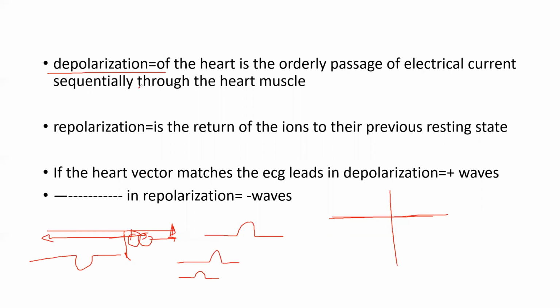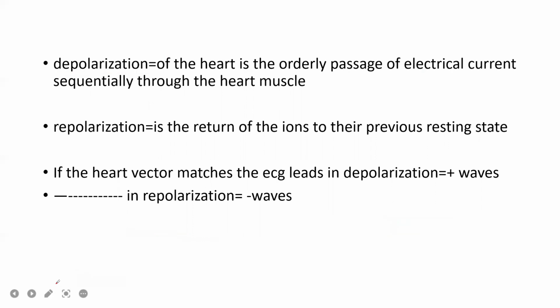So now we have two situations, depolarization and repolarization. Depolarization is moving from the rest mode to the active mode. Repolarization is moving from the active mode to the rest mode. We should concentrate here. If the heart vector matches the ECG lead in depolarization, the wave will be positive. But if it is in repolarization, the wave will be negative.